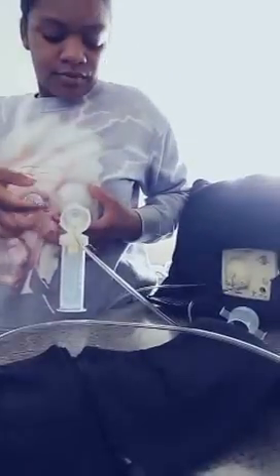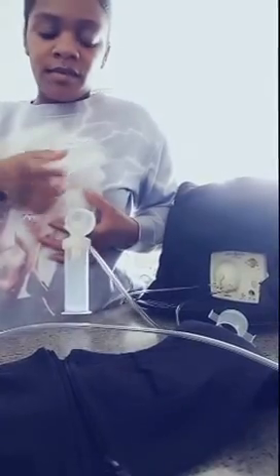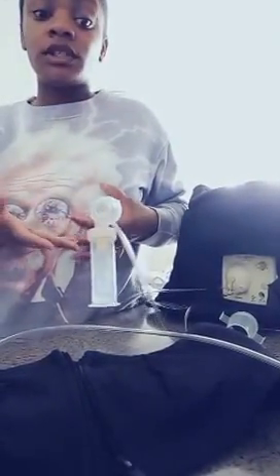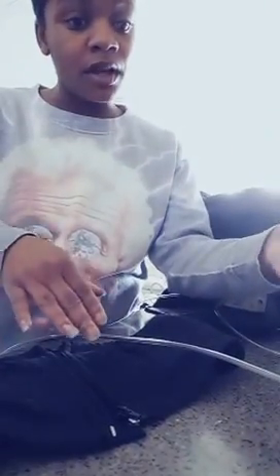So once you have your bra, I mean, not everyone has a bra. Some who don't have a bra will just literally put the shield on the breast, make sure it is comfortable and secure, and just begin pumping and holding. With the bra, you don't have to do that. So that's what I'm going to do now. I'm going to put the bra on and we're going to pump some milk.